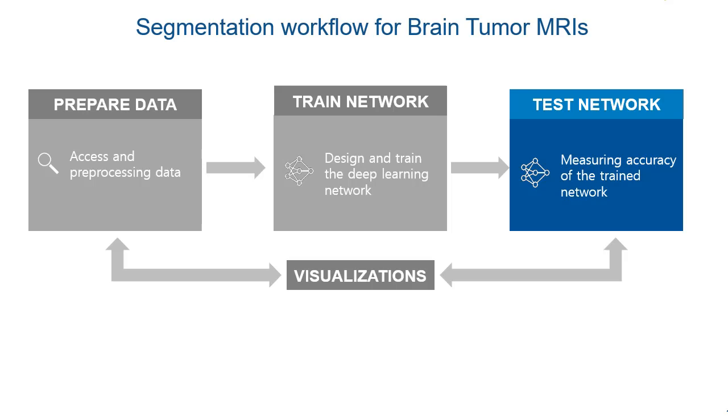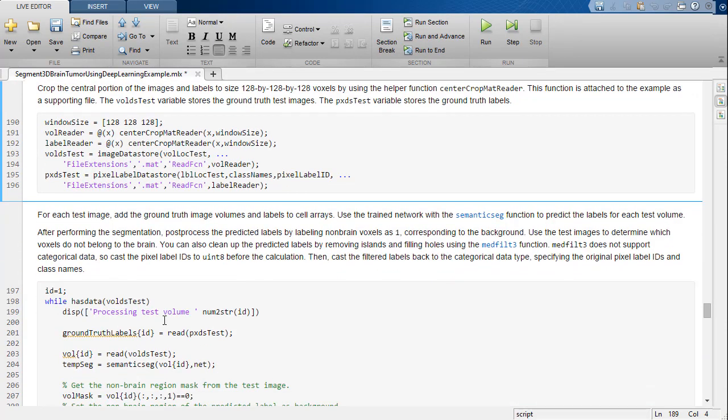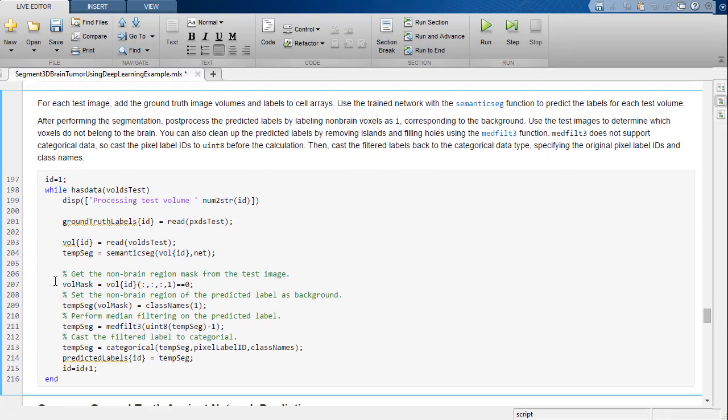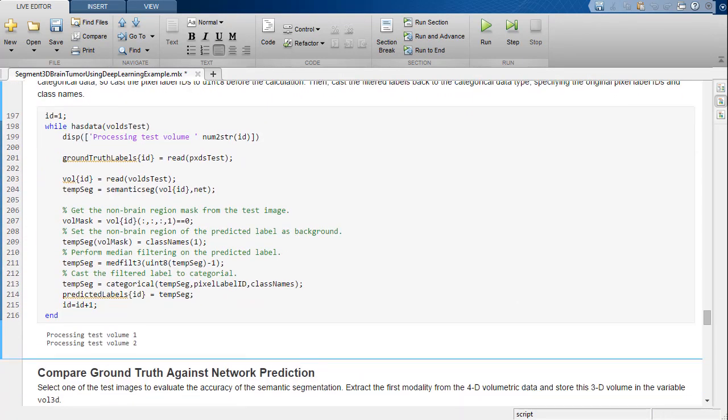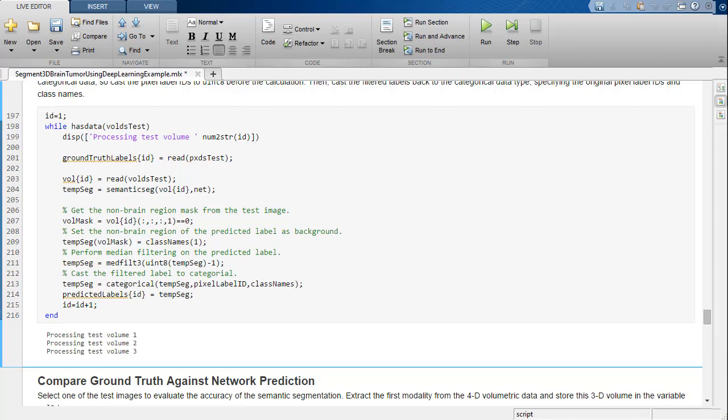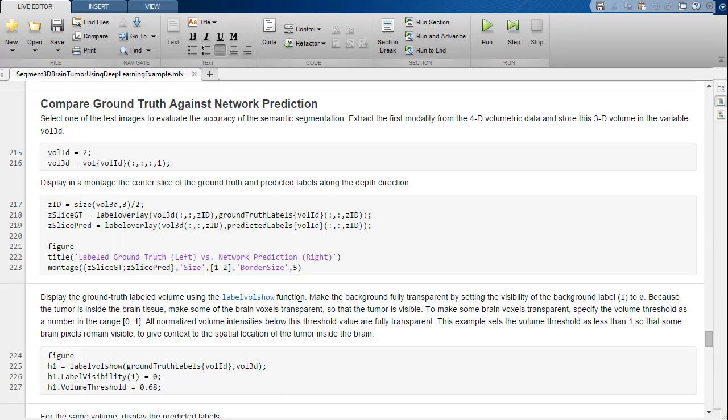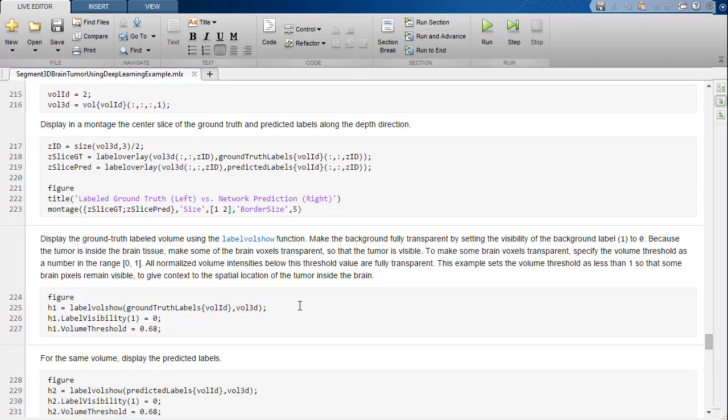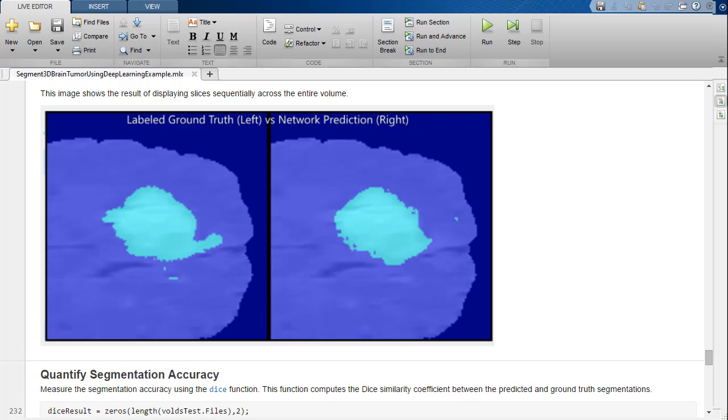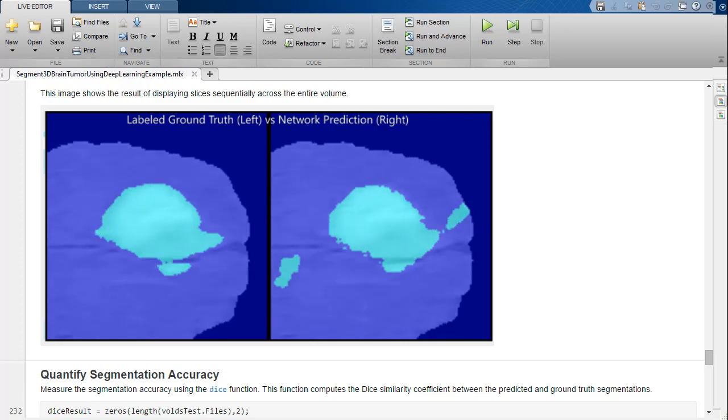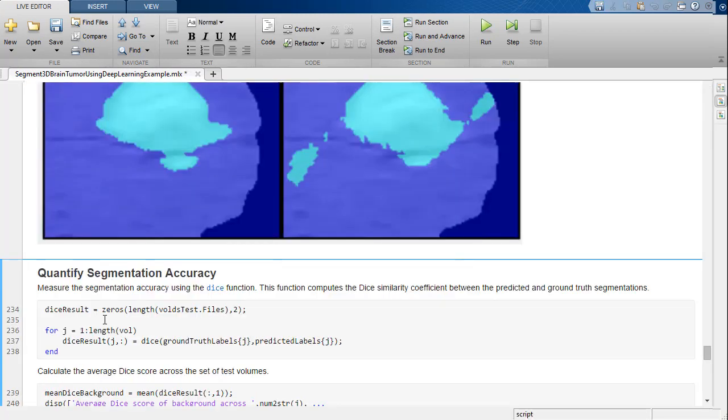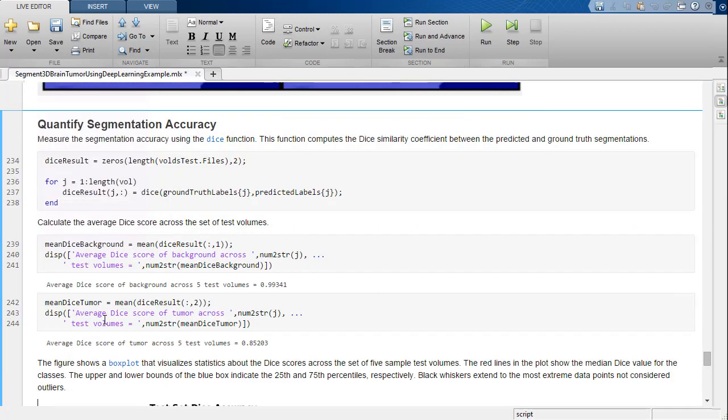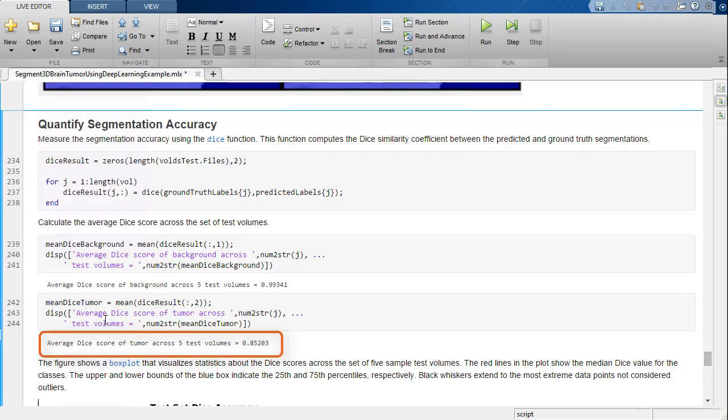Now we will perform segmentation on the test images to check the performance of our network. The sample test data set has 5 images. We can see the predicted segmentation as compared to the ground truth segmentation. Here, the DICE similarity coefficient is used to measure the accuracy of the network, which is 85% for the segmentation of brain tumors.